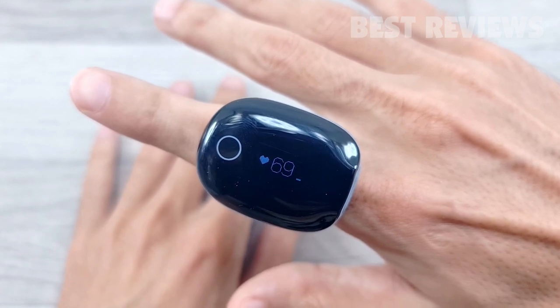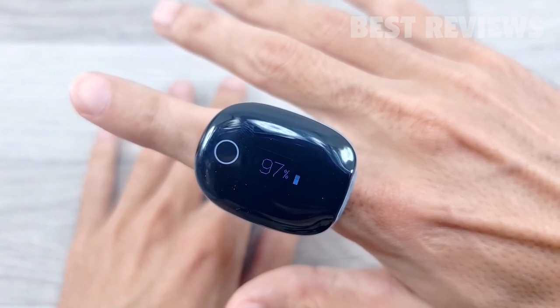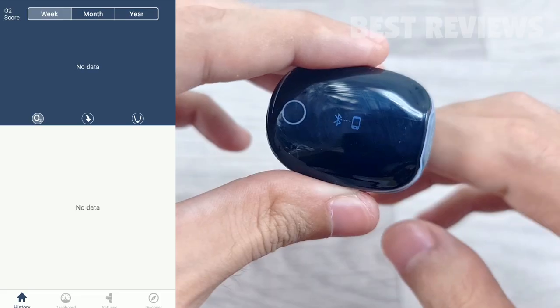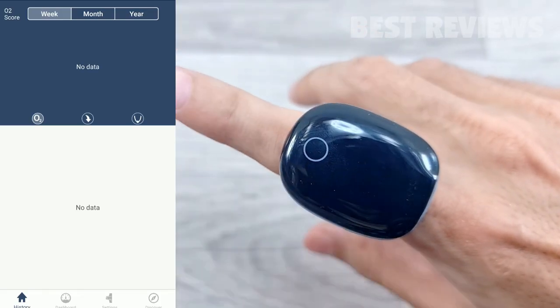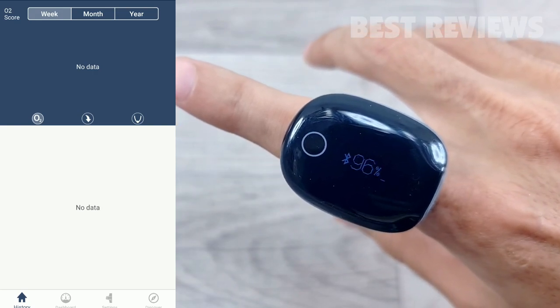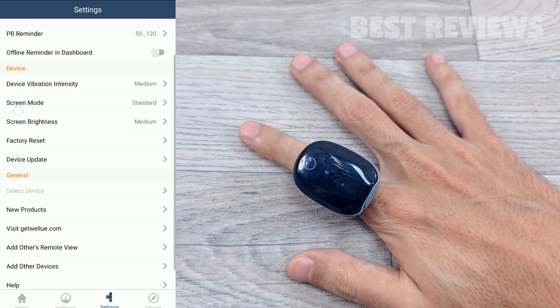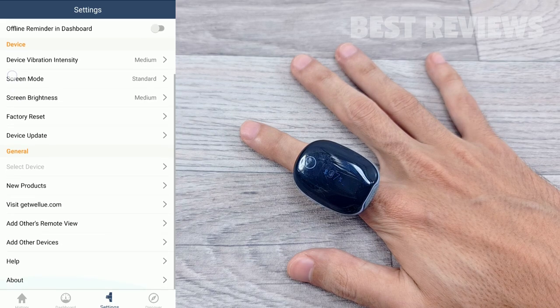The wearable works as a standalone device with a built-in storage memory and OLED touchscreen, or alongside the companion ViHealth app, offering both real-time displays as well as downloadable, detailed reports of nightly, weekly, or long-term sleep data which you can download and share with your doctor.